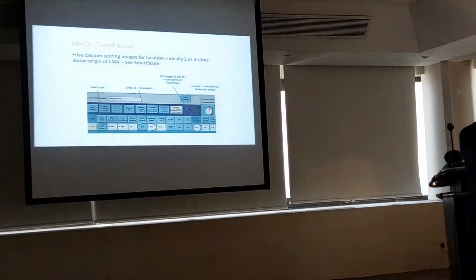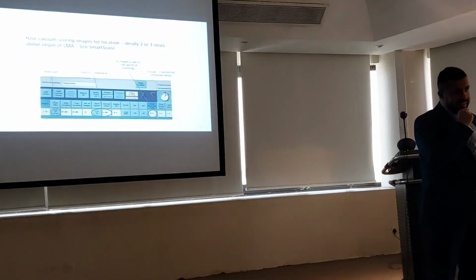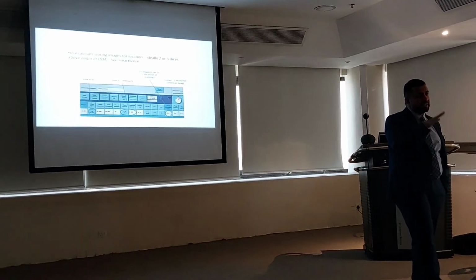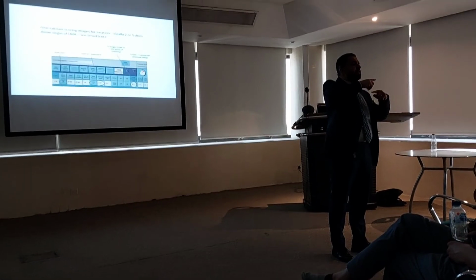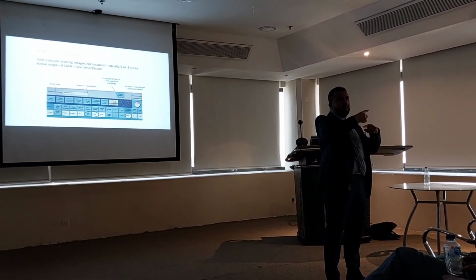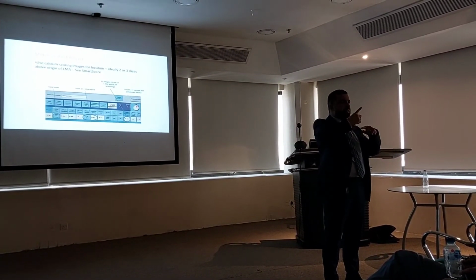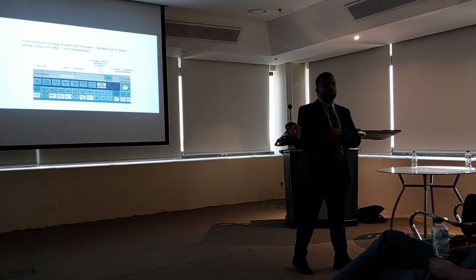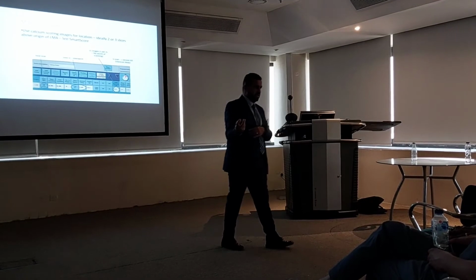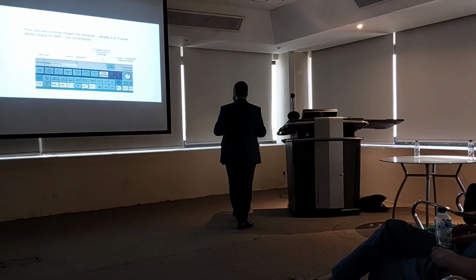It's an axial scan with zero intervals, so the table does not move. It's exposing 1 second and then waiting 1 second, and then exposing 1 second and waiting 1 second, and then exposing 1 second. That's how I can know how many seconds it will need to get the maximum enhancement. You get that? Good.